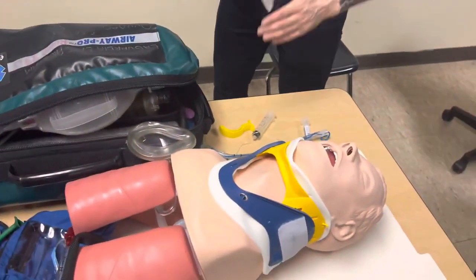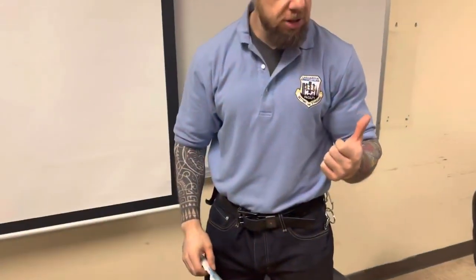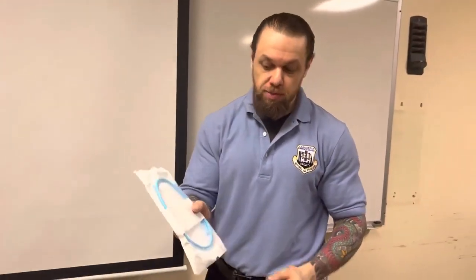So what we're going to do is show you how to intubate somebody in the position where they're lying flat. You cannot align the oral axis, laryngeal axis, and the pharyngeal axis in the mouth to get an optimal view. You cannot. So this is why I'm going to use a bougie. You must have a bougie. Usually when they advocate this procedure, they say you want to have video laryngoscopy, like the video laryngoscope, and then the other one was a bougie.